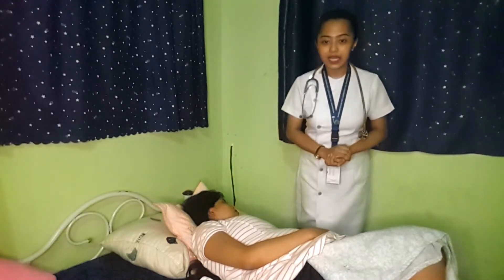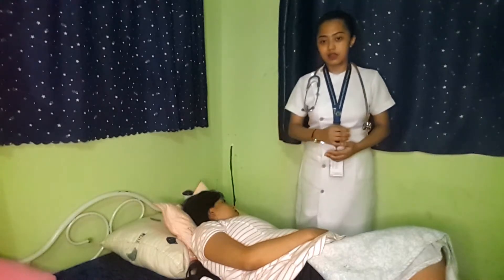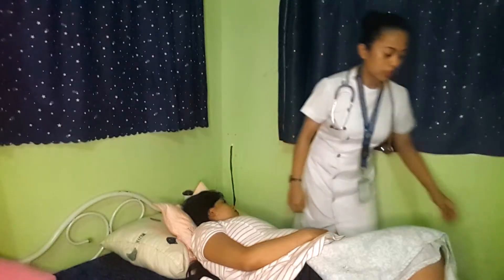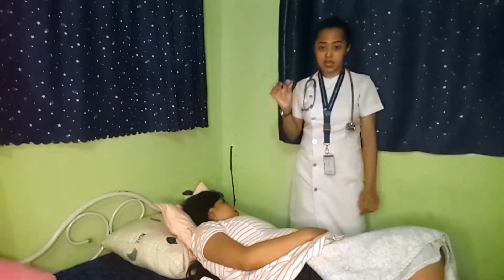For the fundal height measurement, the rationale for doing this procedure is to assess the growth and development of the fetus. Prior to doing this, we need to prepare our equipment, which is the tape measure, in order to measure the fundal height.